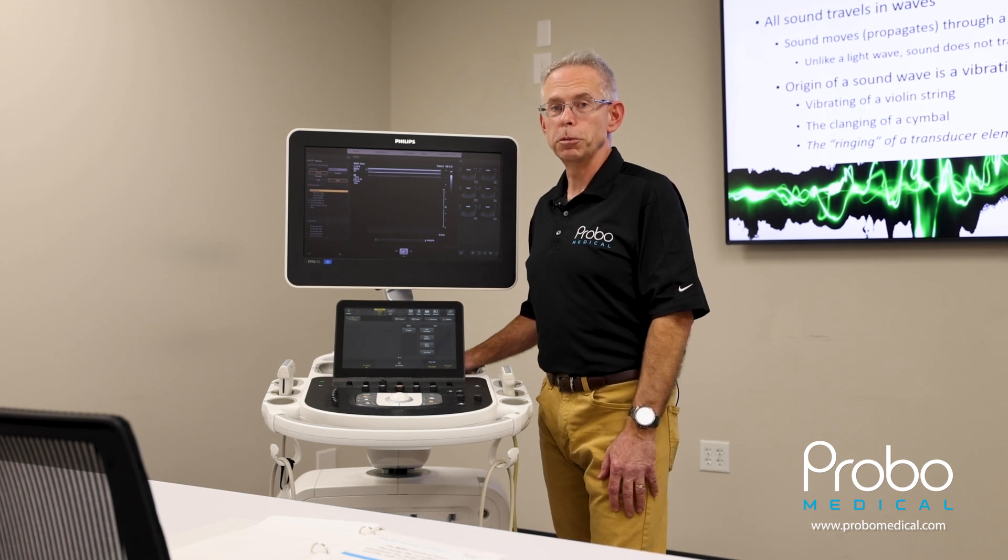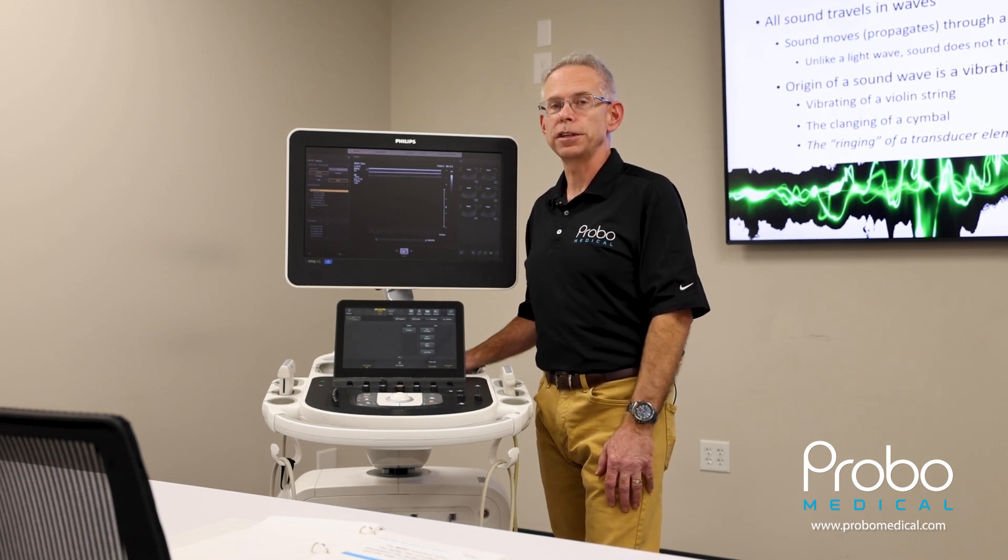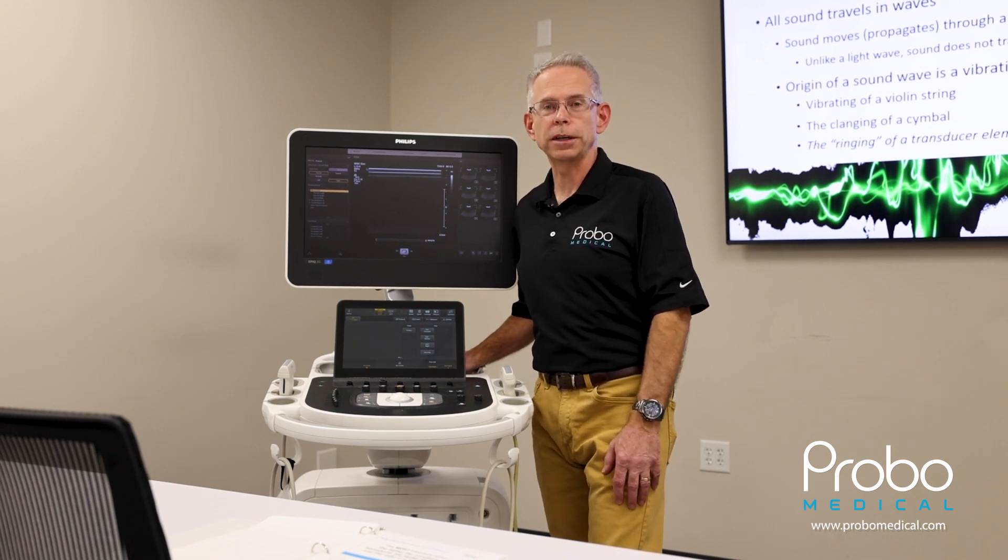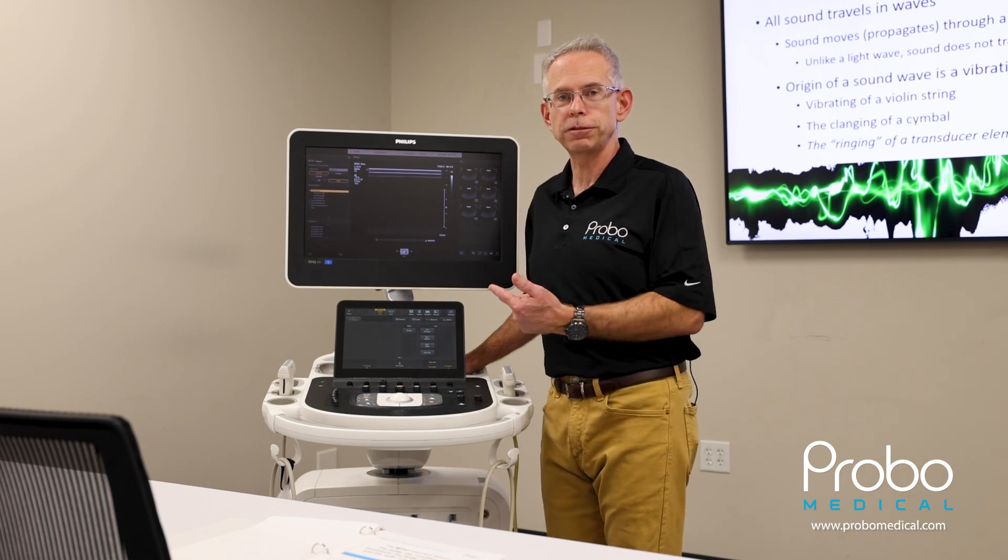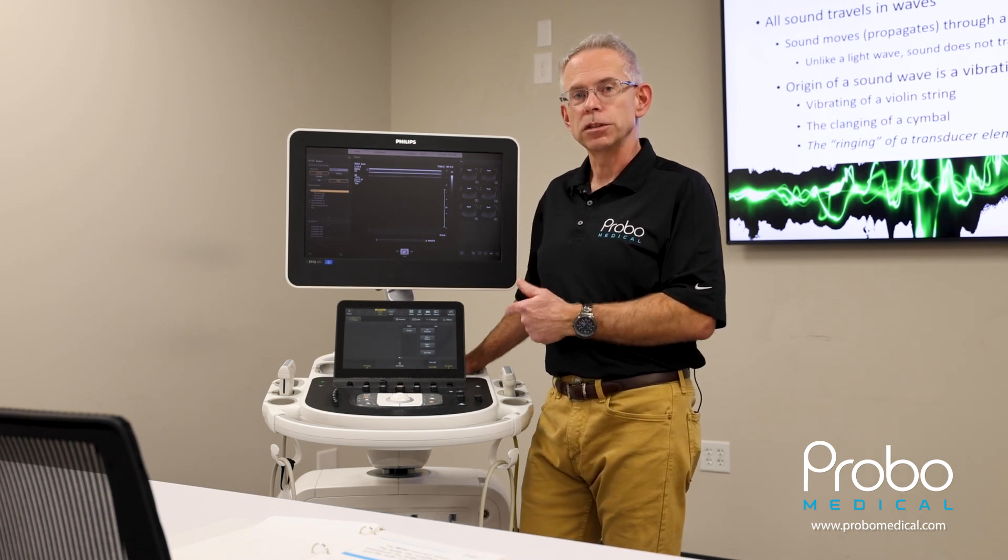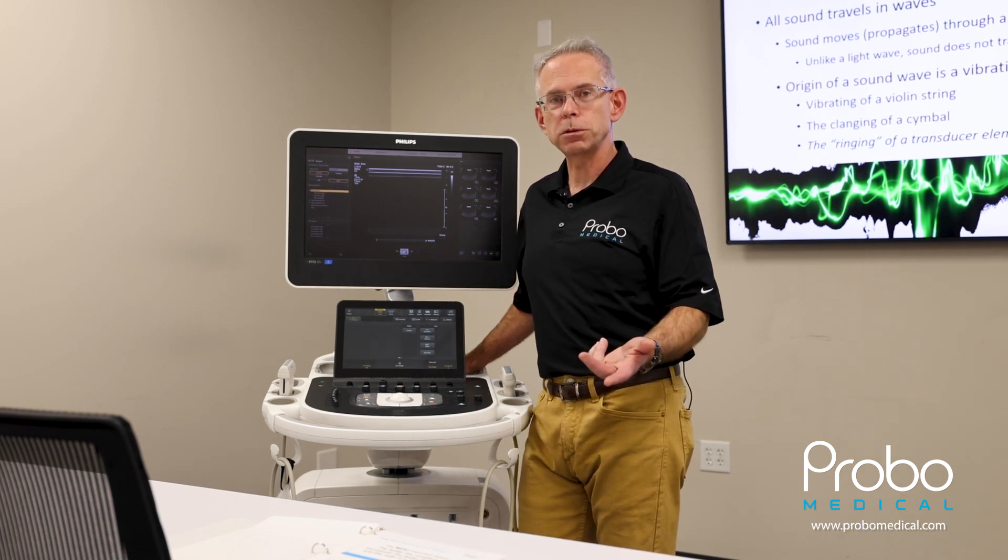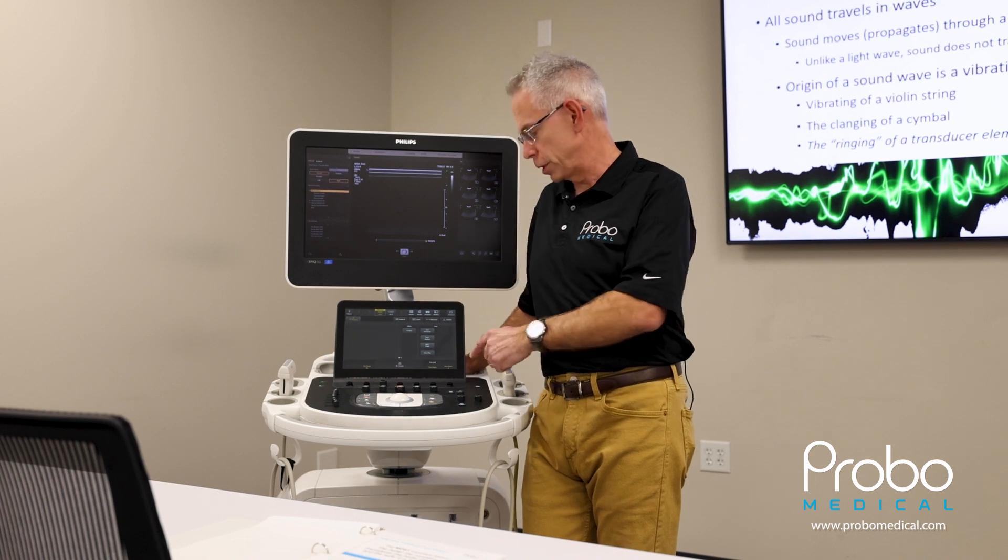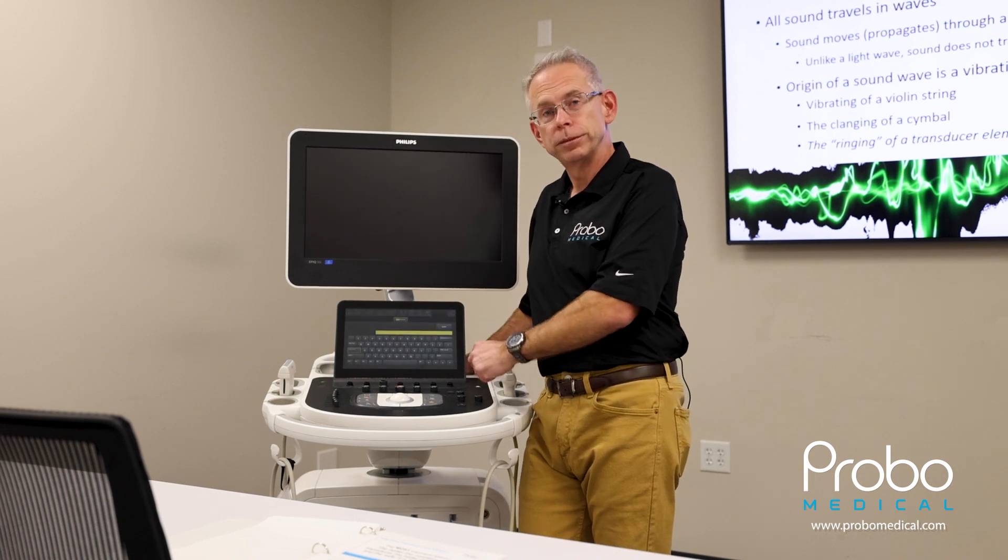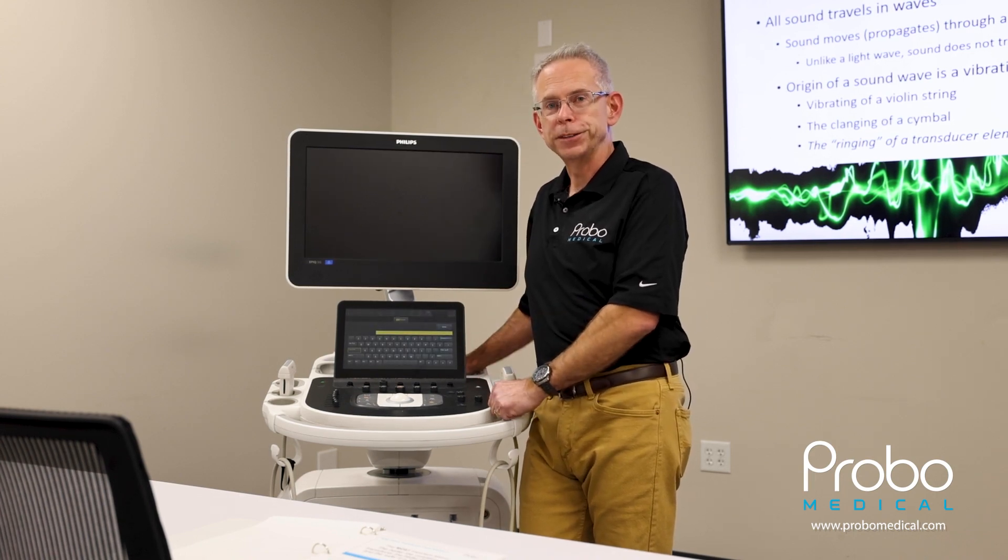Hi, this is Hobie Sears with Probo Medical with another Hobie's Hints. Today, we're going to talk about DICOM setup on the Philips Epic and Affinity. So once you have all of your DICOM information ready and you're ready to dive into the unit, press support and we'll pick up from there.